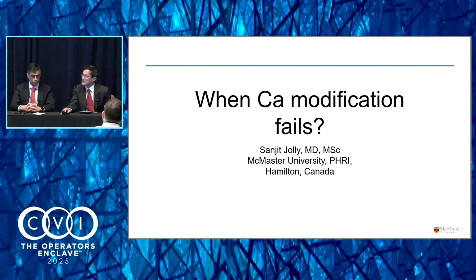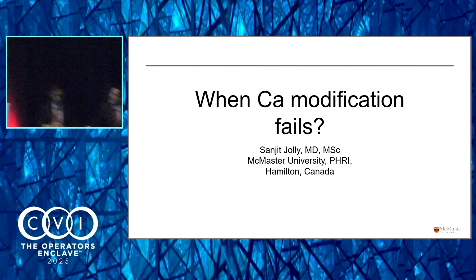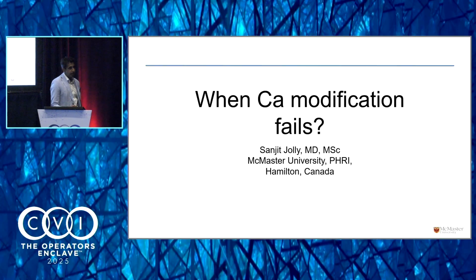What do you think? You described several cases here where the calcified nodule didn't scare you from using the OPN balloon. Is this a preferred device then? I think the randomized trials will tell us, because we've got a subset, nodular calcium is included in the trial. So I think the jury's still out. We have registries suggesting it's fairly safe. But if you believe Shockwave, you should use Shockwave in every nodule. The question is, we don't have randomized data to support that. So that's where I think, with Eclipse, if you had believed Eclipse before that, everybody should get orbital who has a nodule. And clearly that's probably not the case. It's only a subset that need atherectomy.